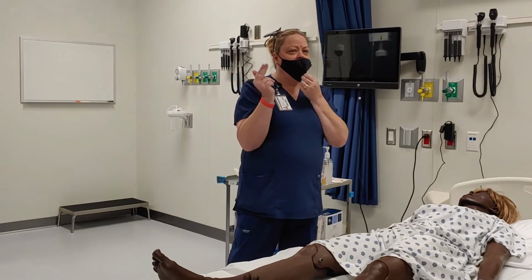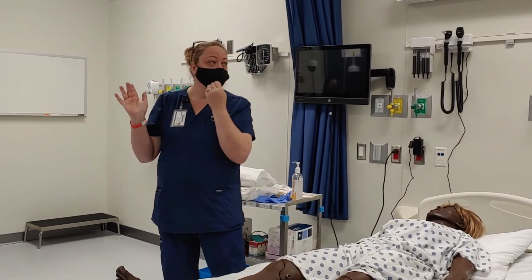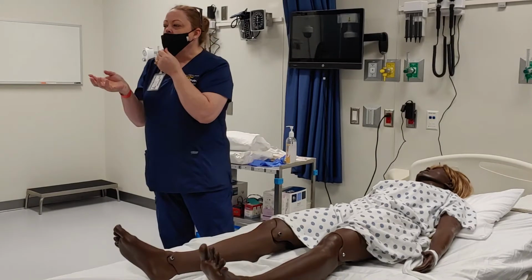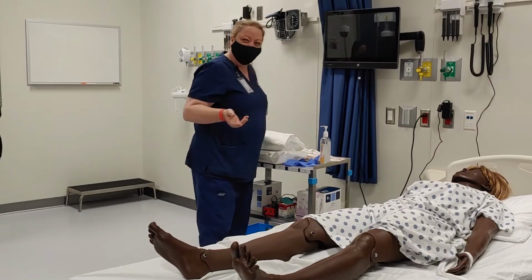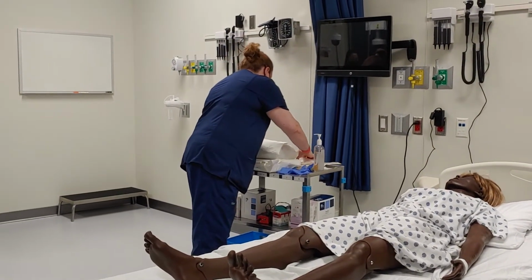How many of you have ever had a catheter before? Anybody? When you give birth, don't they go on? Not always. Not always. Occasionally. Okay. So, if you've known anybody that has it, you'll hear them say that it is just kind of pressure. All right. So I want to show you a couple different kinds that we're looking at here.